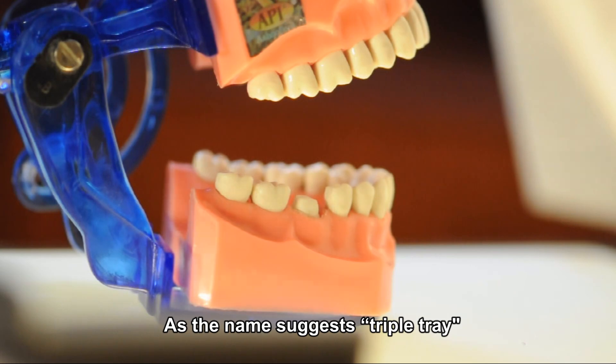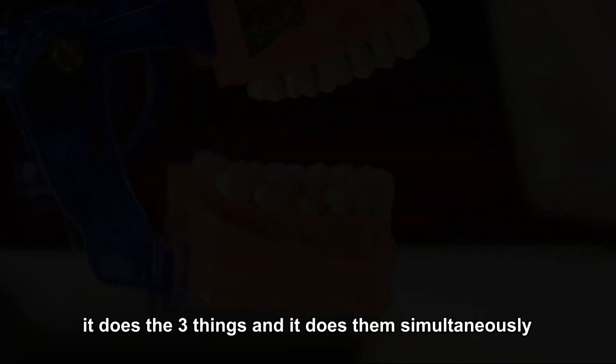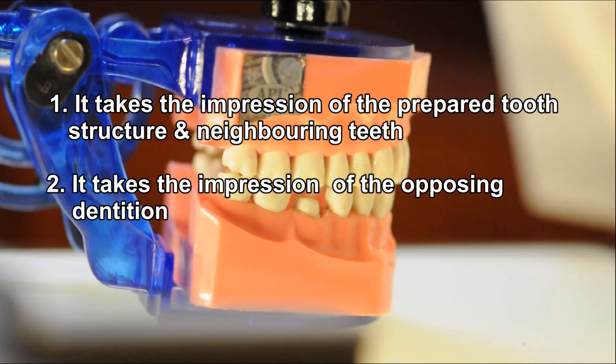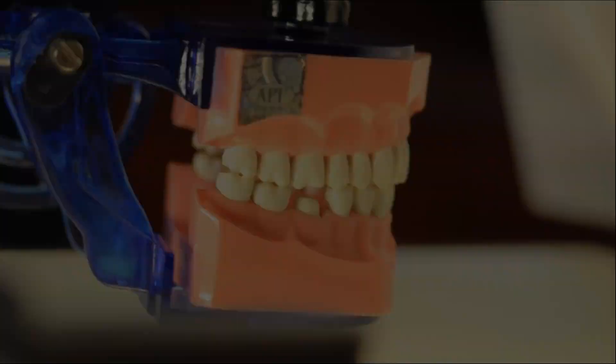As the name suggests, triple tray does three things simultaneously. First, it takes the impression of the prepared tooth structure and the neighboring teeth. Second, it takes the impression of the opposing dentition, and third, the bite registration.